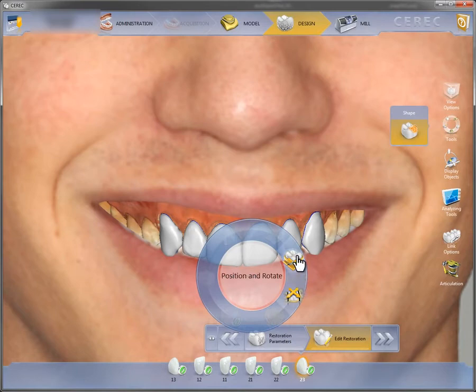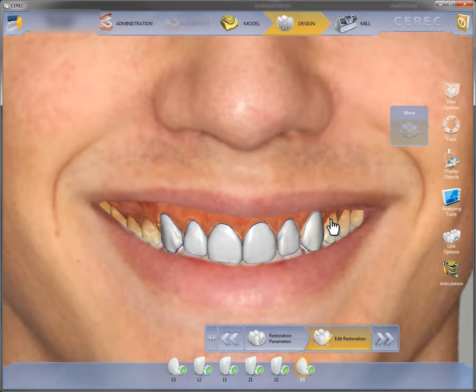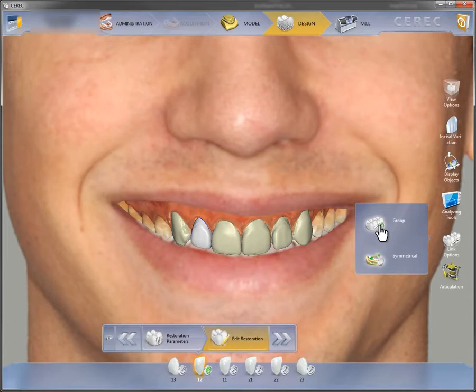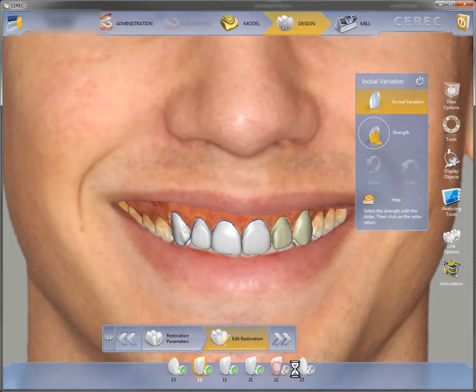We now have the advantage that we can assess the construction in the context of the patient and can therefore better assess the effect of the tools that we are using. In this case, for instance, we use the symmetry tool or the group tool. This allows us to change the entire front in one go and we see this entire front in real time.